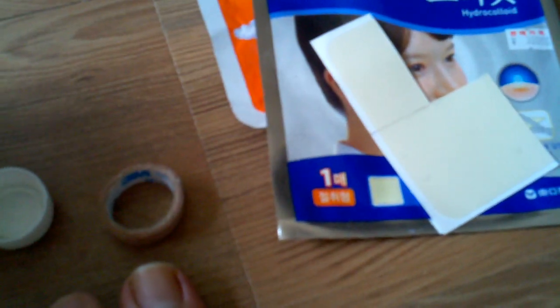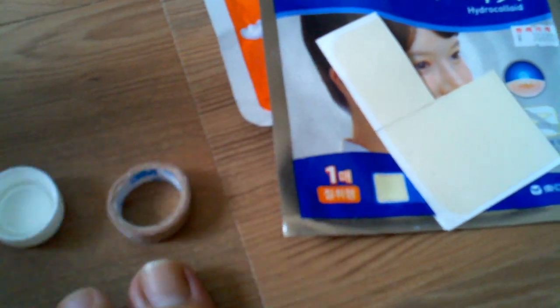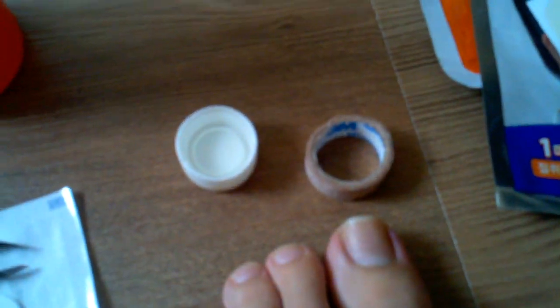So pour yourself a little bit of hydrogen peroxide. I have some gauze here. What I do is I make myself a nice little ball, and you can do this with or without tweezers. I'm just going to do it with tweezers in case you have to do it with somebody else, just to illustrate. So I get some nice hydrogen peroxide on there. Let it soak up the hydrogen peroxide. Now I'm not going to lie, this is definitely going to burn, depending on how fresh the wound is.